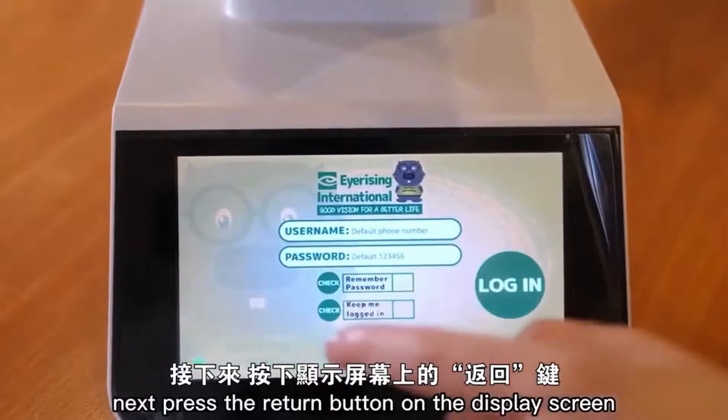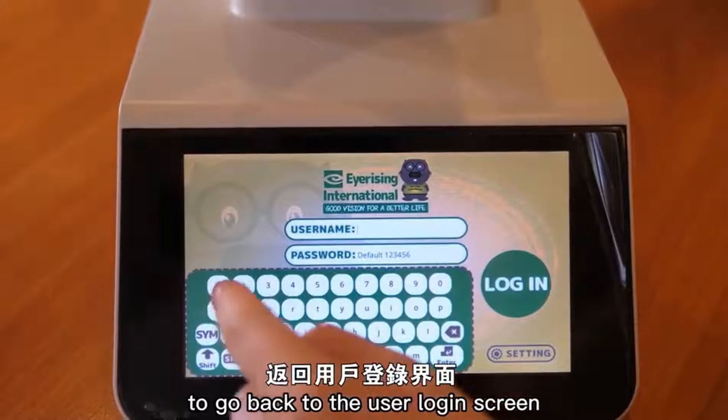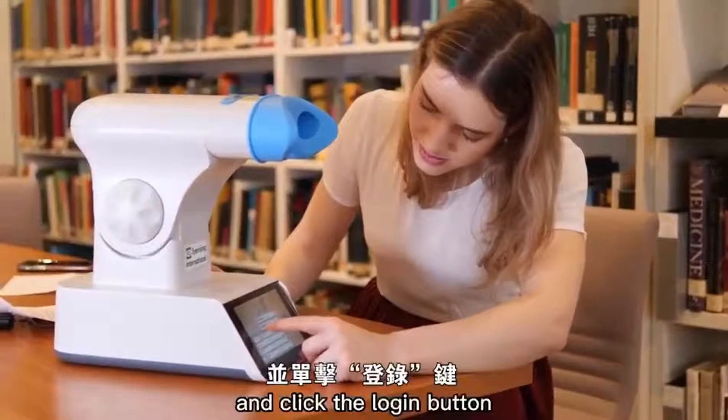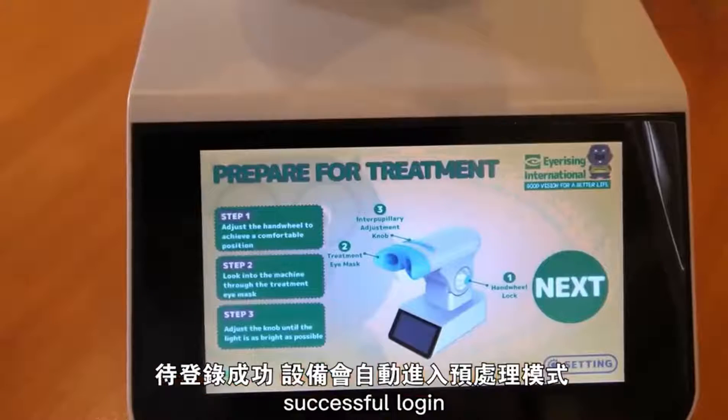Next, press the return button on the display screen to go back to the user login screen. Enter your username and password provided at sign up to the trial and click the login button. The device will enter the pre-treatment mode after successful login.